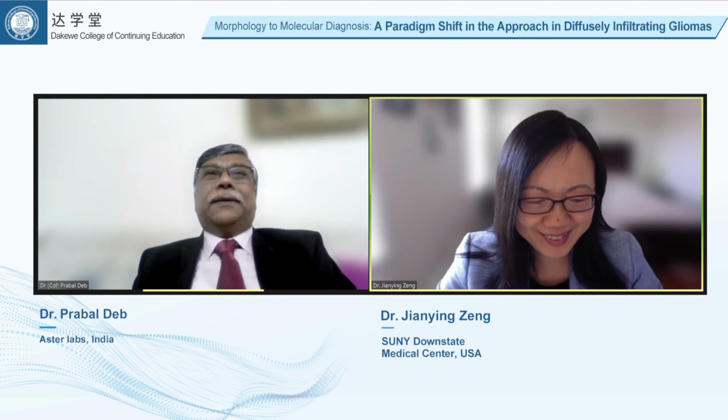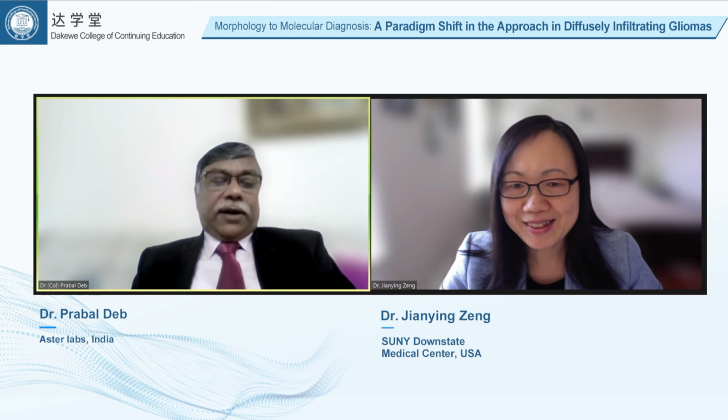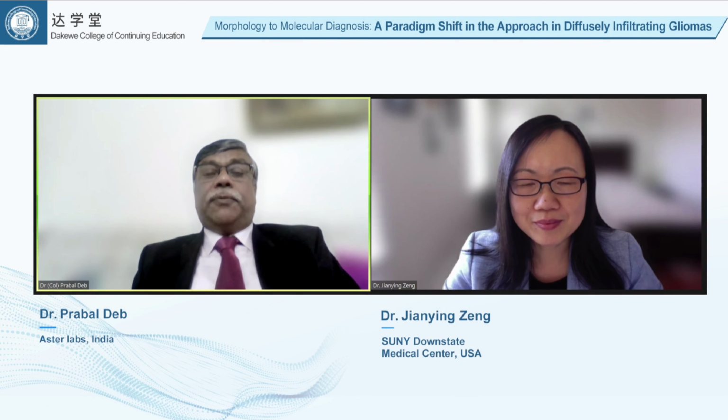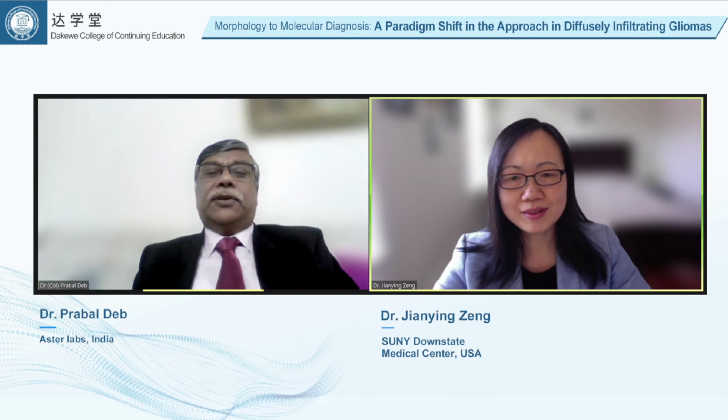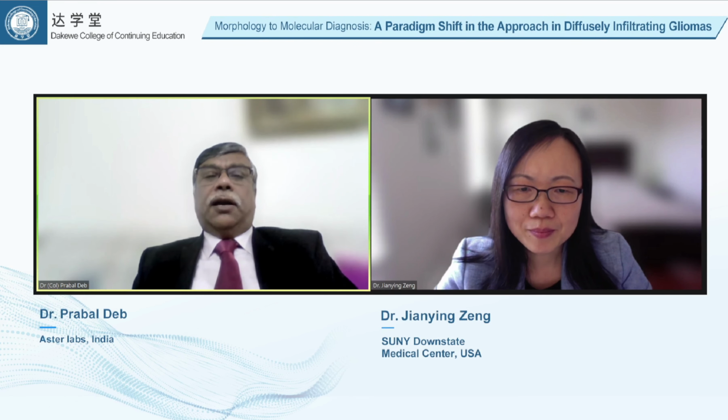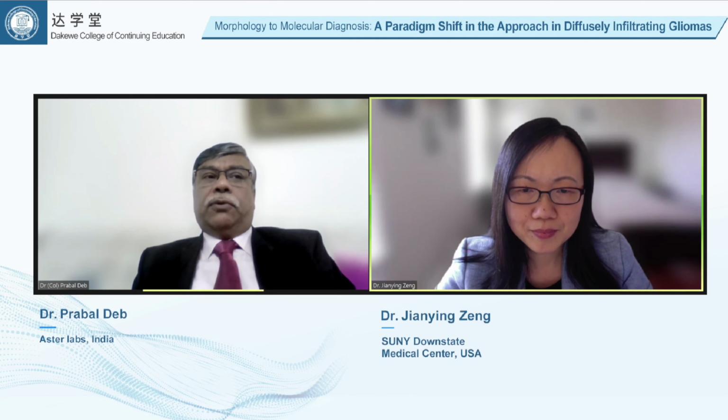Yes. For me, before I look at my slide, I generally go through the clinical and radiological profile before I even get into the slide. Otherwise, many times, just looking at the morphology might misguide you, especially if the biopsy has been taken from an area around the tumor. And then you have to get back.